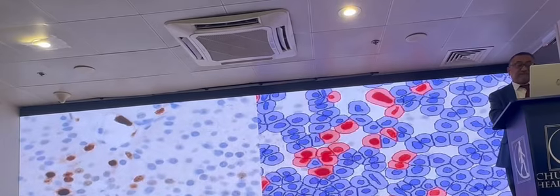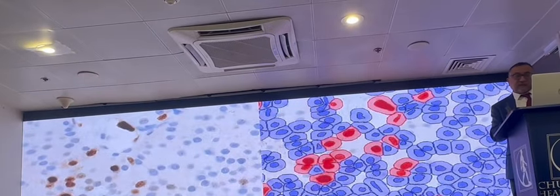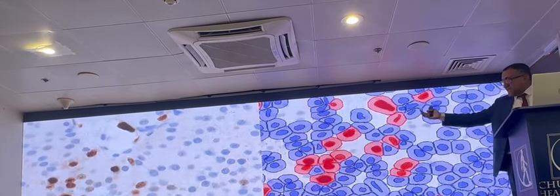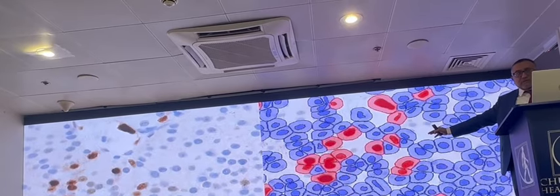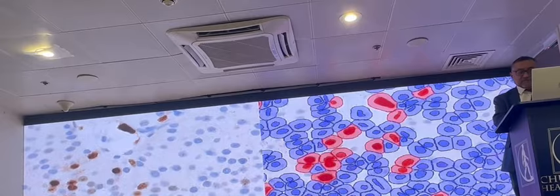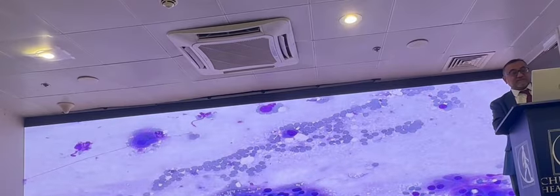This is the lab information system. So you can see now we can start to quantitate the IHC. We can scan the IHC with the same scanner, but now we can run software on top, which can quantitate the biomarkers. So the image quality is pretty good. We can even get cytology, decent cytology images.